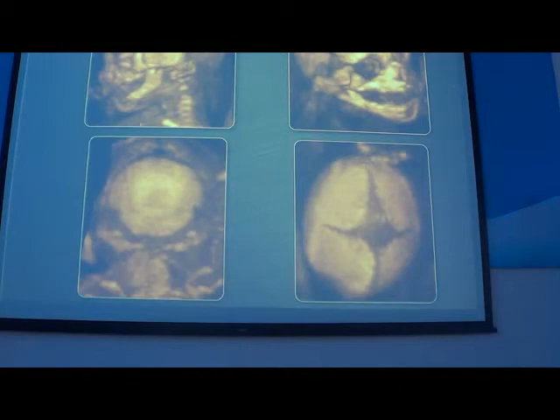And with 3D, it's quite easy to do it because you can work with the maximum mode, and with the maximum mode we can see all the skeleton.